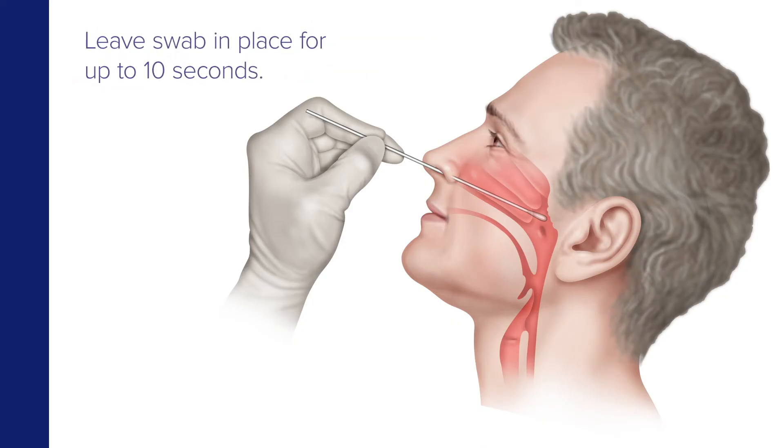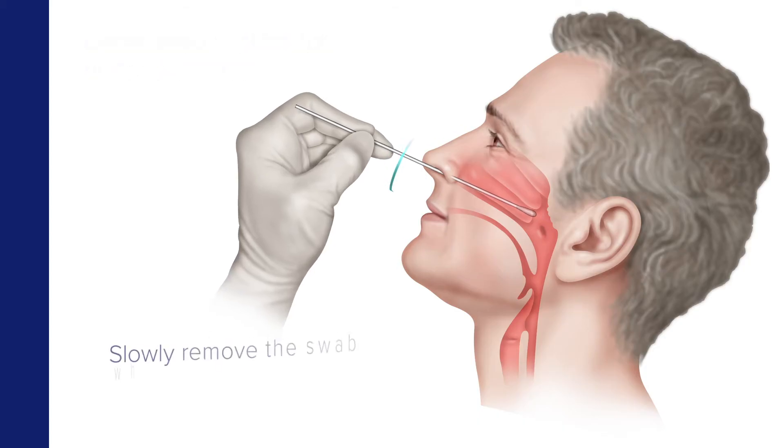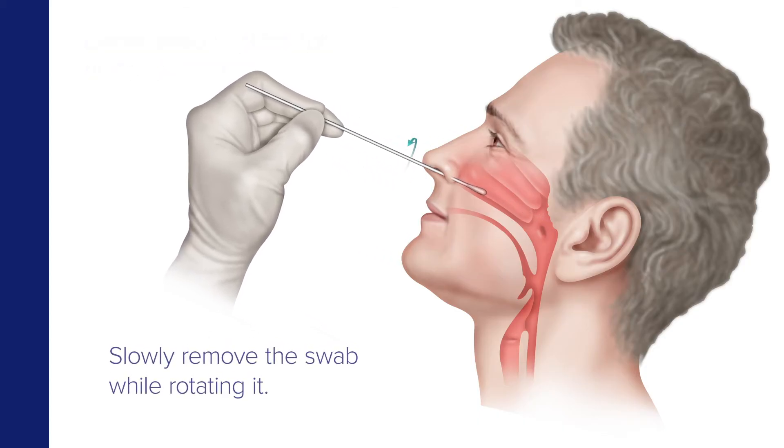Now leave the swab in place for up to 10 seconds to absorb secretions. Then slowly remove the swab while rotating it.